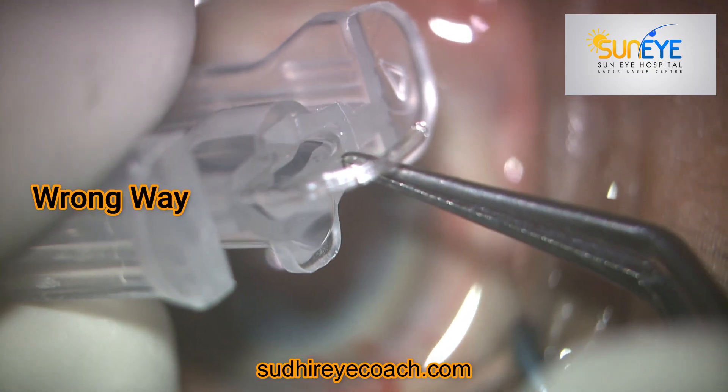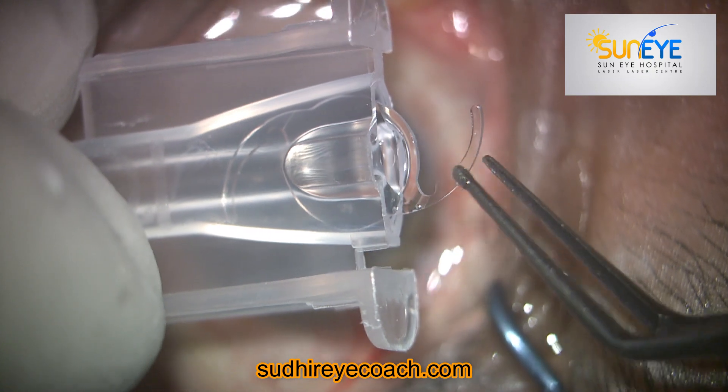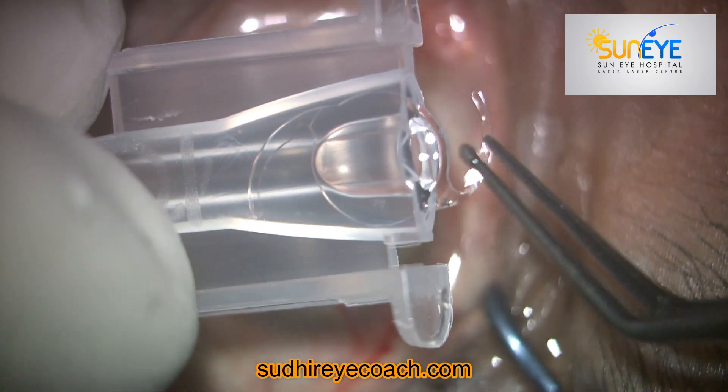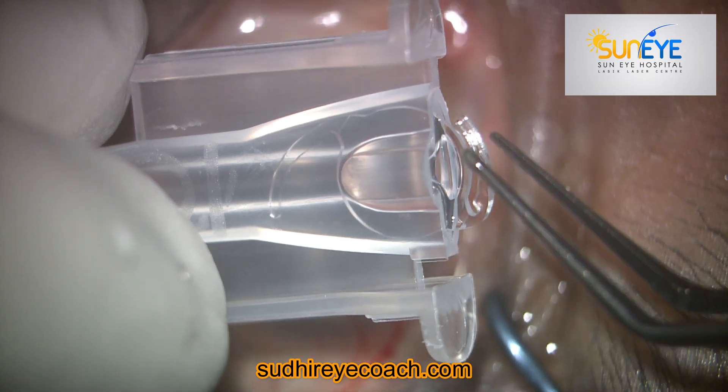For biometry and power calculation, you can use the same approach you are already using for Tecnis IOL implantation — nothing changes in the way you perform the biometry.